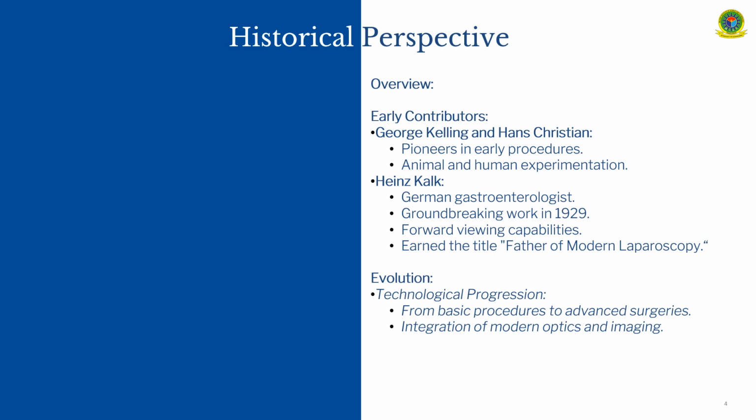Historical perspective. Like other devices, we know all the modern devices have evolved through several decades, and the laparoscopy device is no different. There are early contributors like George Kelling and Hans Christian Jacobaeus. They were pioneers in early procedures. They did animal and human experimentation.